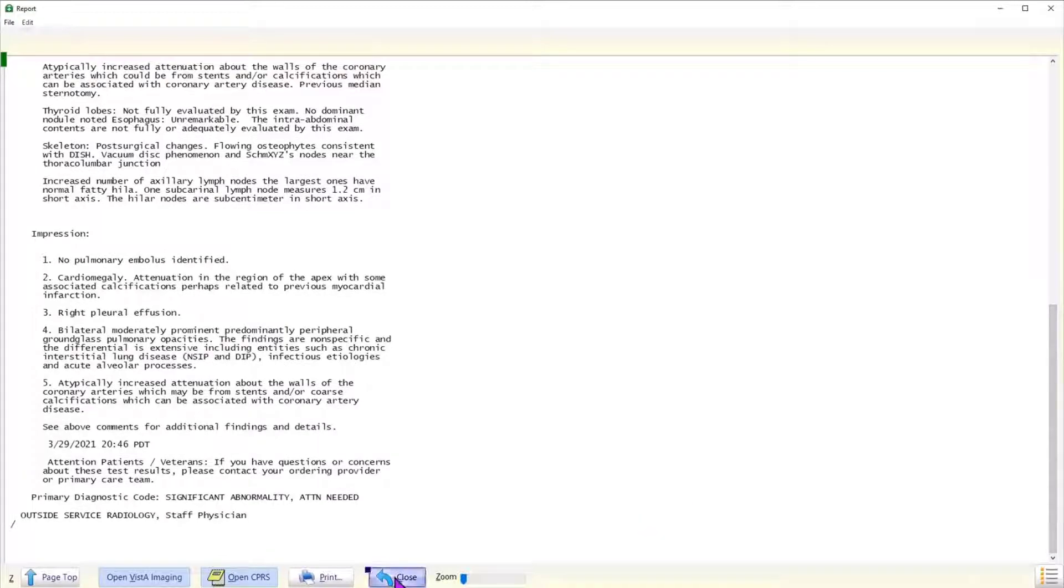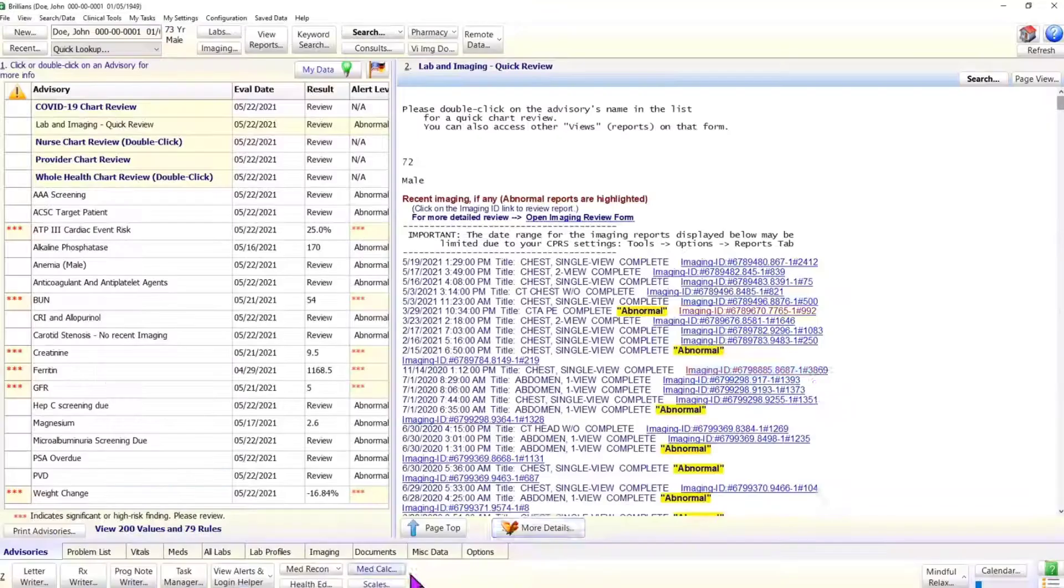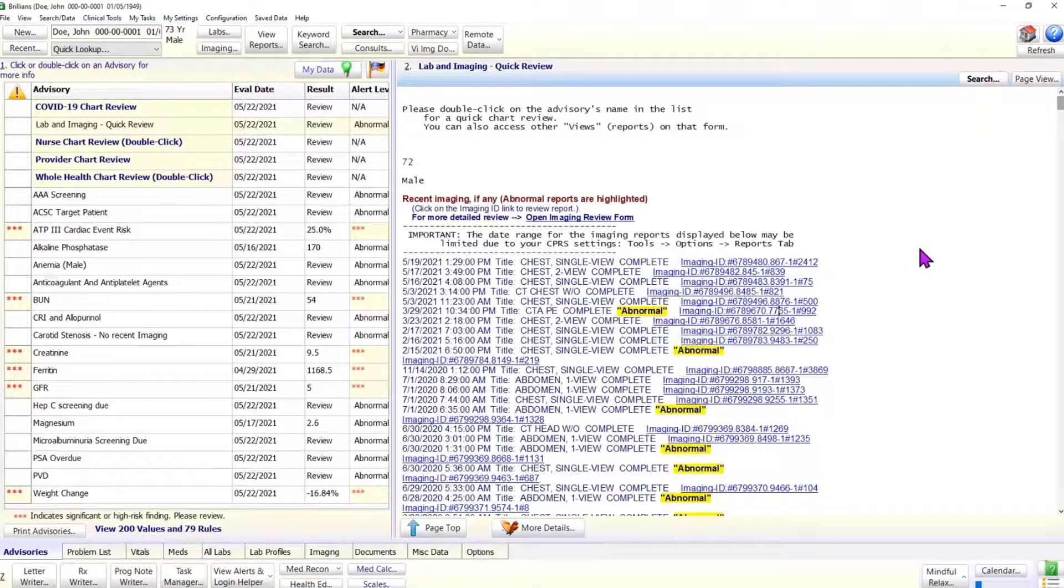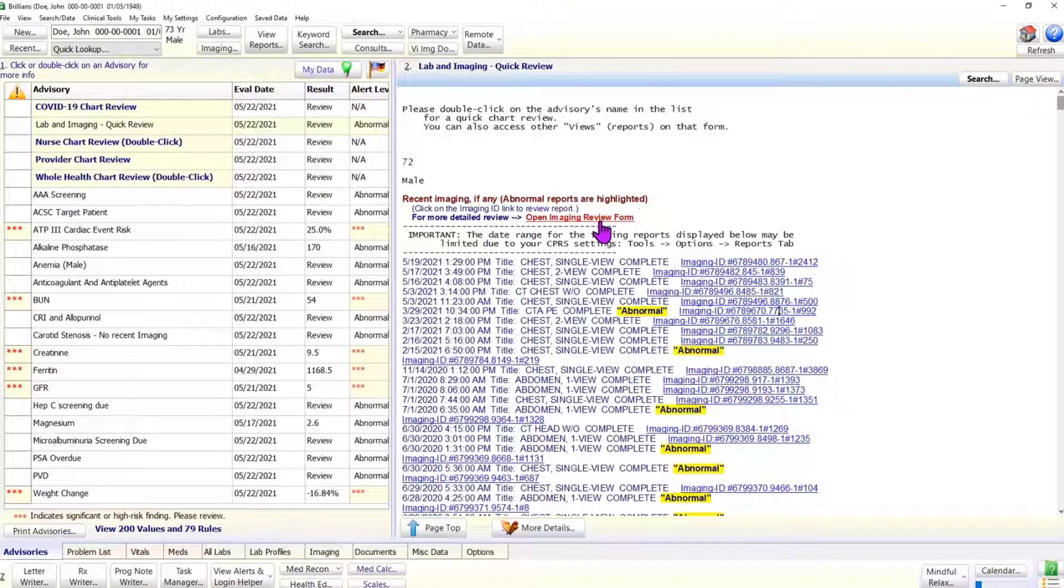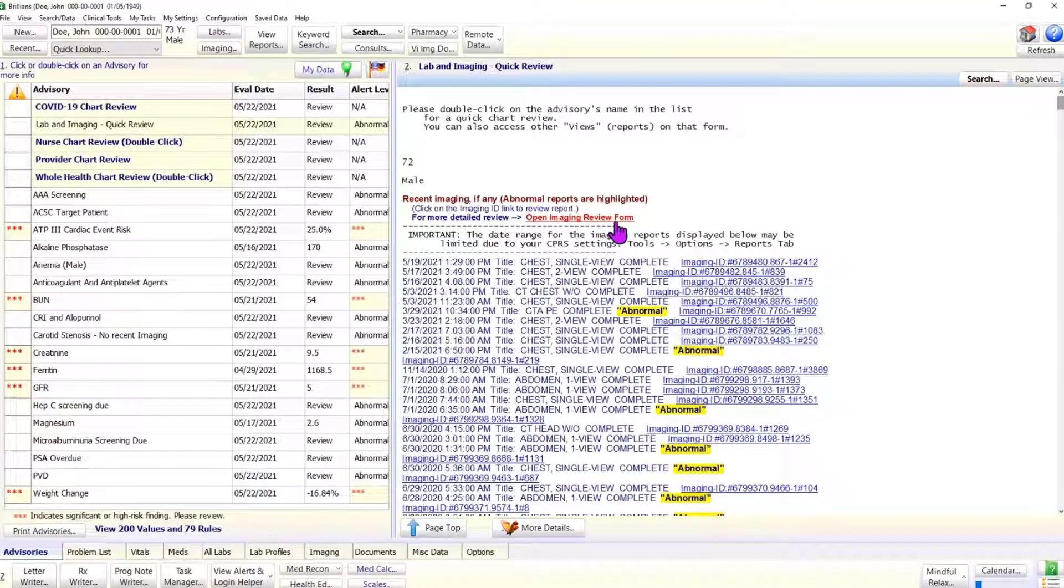For a more complete imaging review, the user can open the imaging review form using the hyperlink as shown in the image. You can also open this form using a button on the top panel.